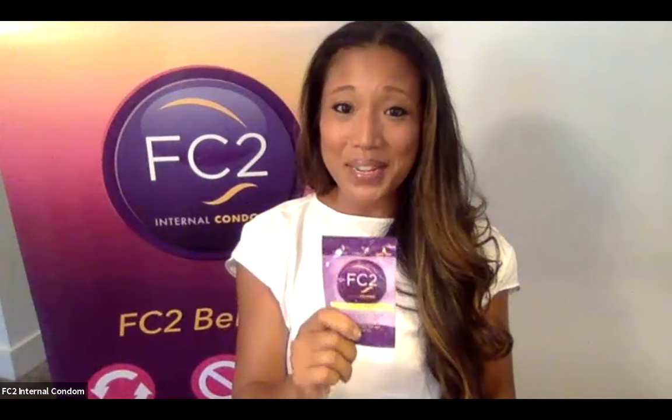Now before you open any condom package, internal or external, it's important to always check the expiration date printed on the package and check the package for any holes or tears. If that expiration date has passed or if the package is damaged, throw it away and begin again with a new FC2 internal condom.